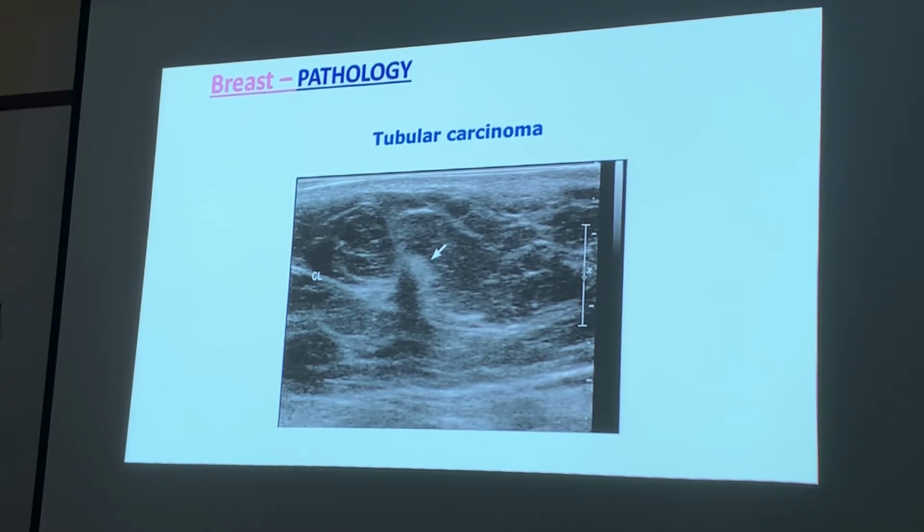If I was doing breast, it would be difficult for me to see those, because I'm not used to that. And that's why you have to move very slow, because that tissue layer can look the same throughout, even though you might slide over something like this and miss it.